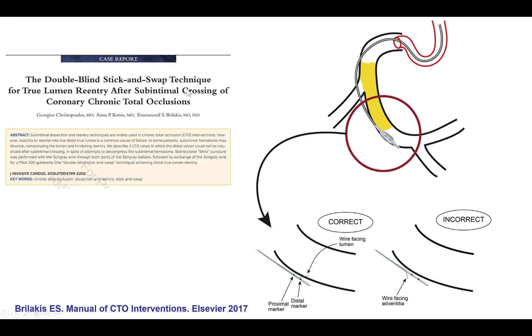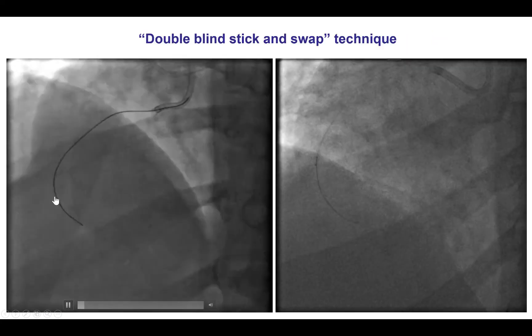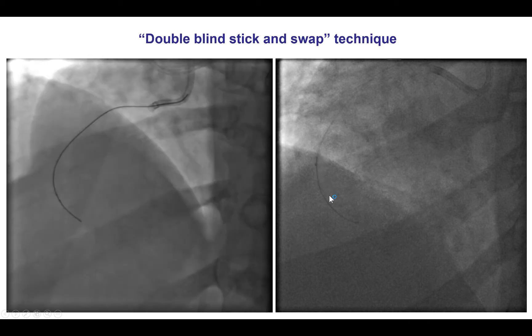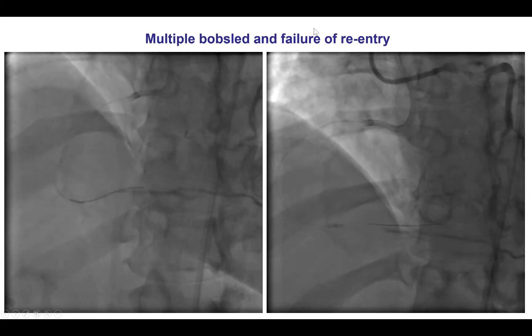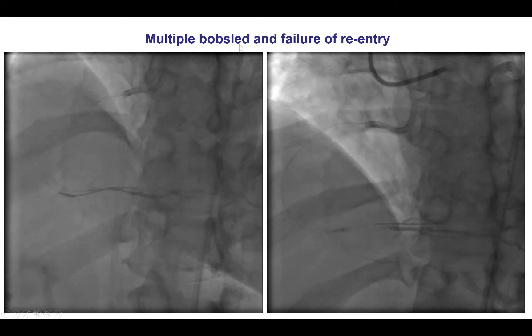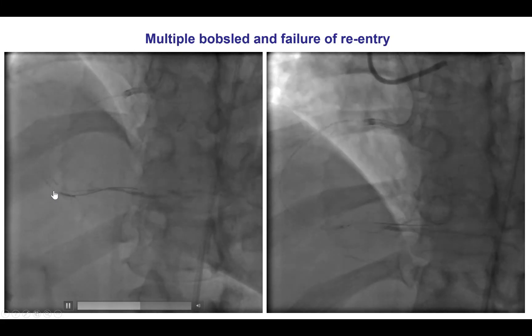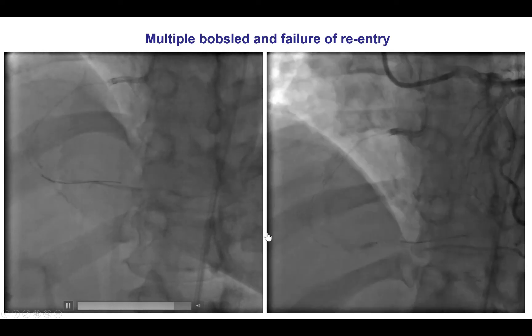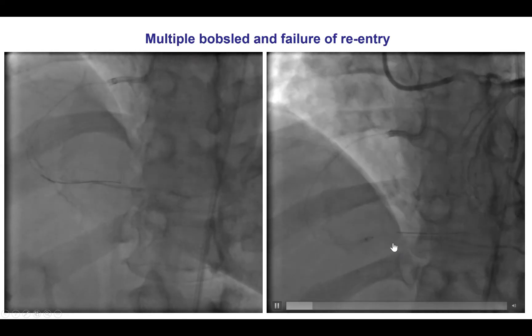We used the double blind stick and swap technique, in which the Stingray wire is advanced through both ports — the one between the two markers and the one proximal to the proximal marker — then removed, and a Pilot 200 is advanced to find the port connecting with the true lumen. We advanced the wire through both the proximal and between-marker ports, but were unable to enter the distal true lumen. We then used the bobsled technique, advancing the Stingray balloon further down to attempt re-entry at a different vessel location, but again could not enter, most likely due to subintimal hematoma formation.